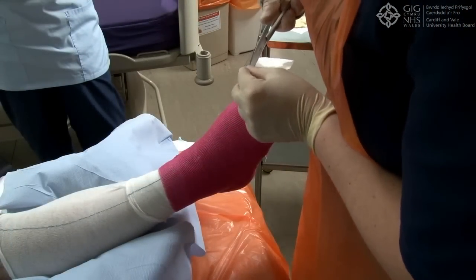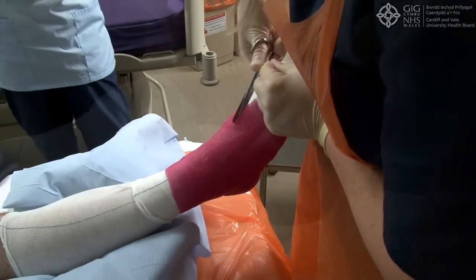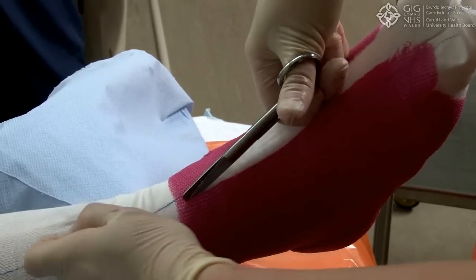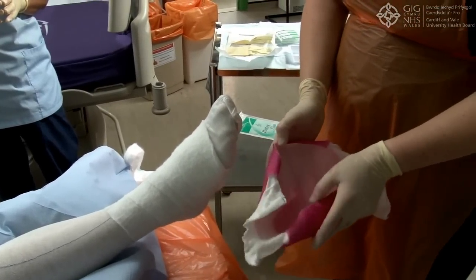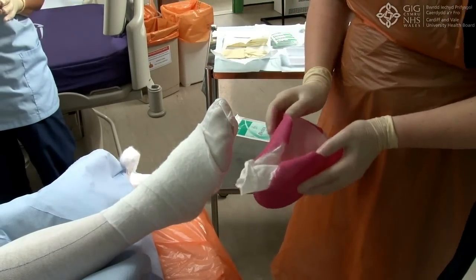Holding the top layer of Tubifast, cut the cast open along the dorsum or top of the foot, cutting against the folded layer of wool, being careful to avoid trauma to the skin beneath. Remove and inspect the cast to ensure there are no ruckles in the cast lining and creases in the plaster.